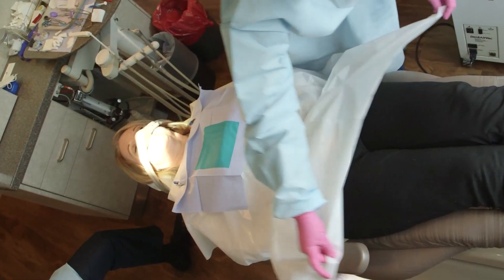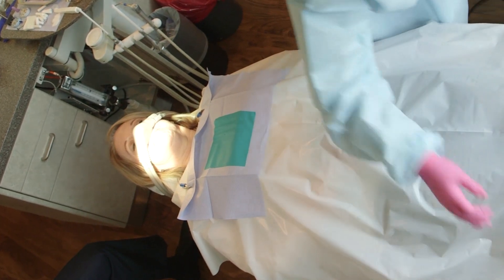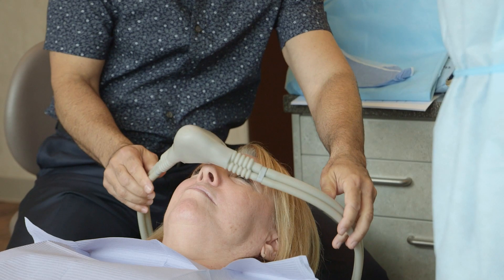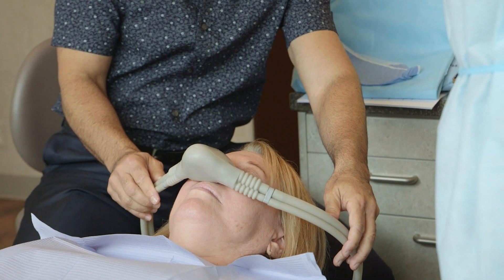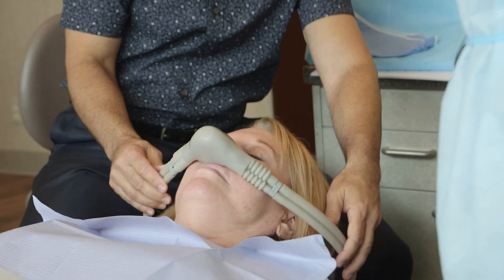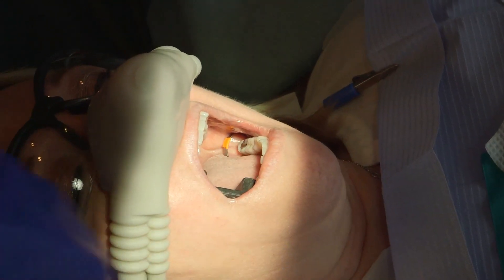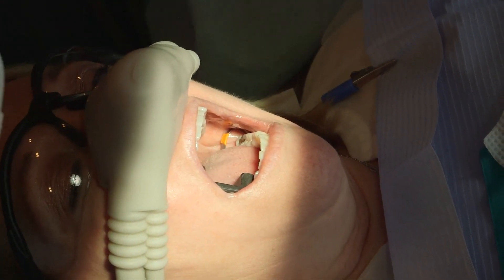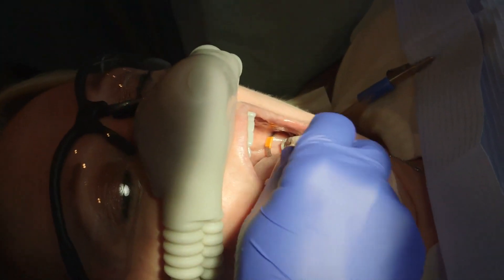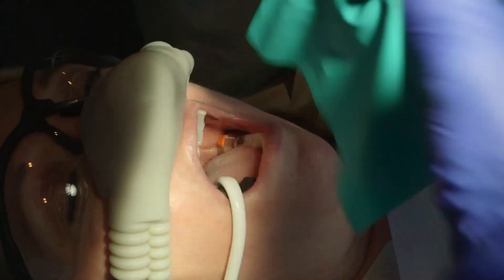In order to protect the patient's skin and clothing, a full body impermeable barrier should be utilized. External air or oxygen delivered via a nasal mask for the patient should also be utilized to assure the patient does not inhale any mercury vapor or amalgam particulate during the procedure. A nasal cannula is an acceptable alternative as long as the patient's nose is completely covered with an impermeable barrier. A saliva ejector should be placed under the dental dam to reduce mercury exposure to the patient.